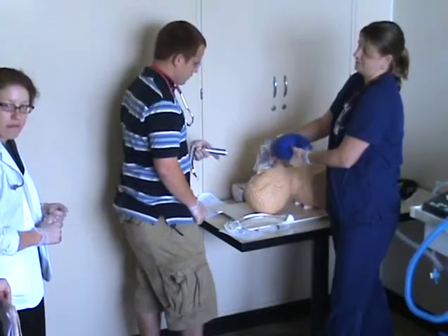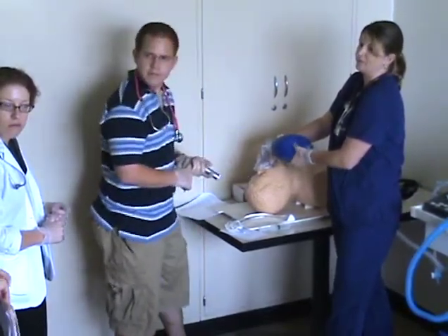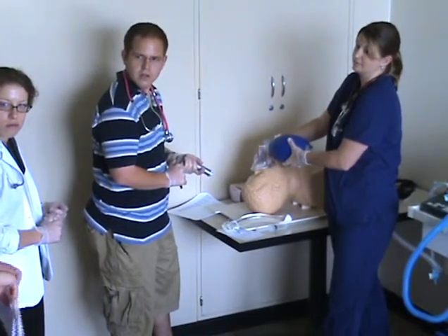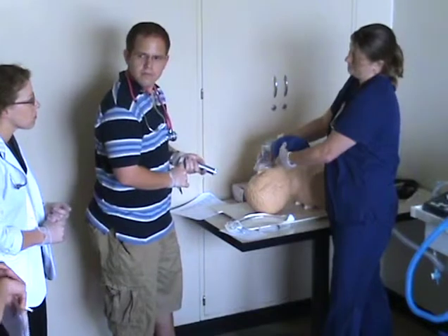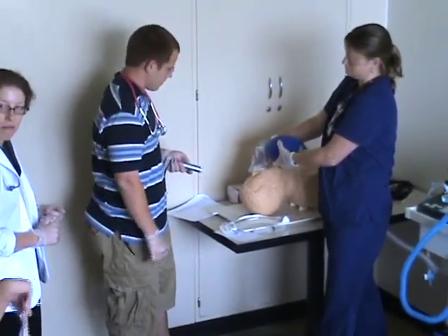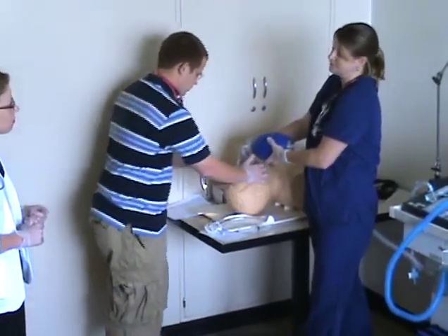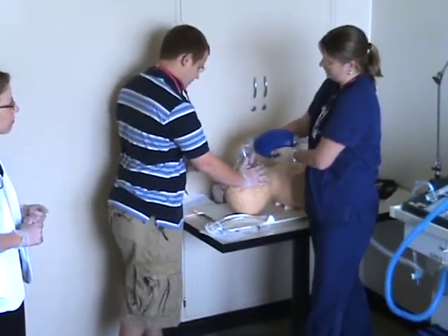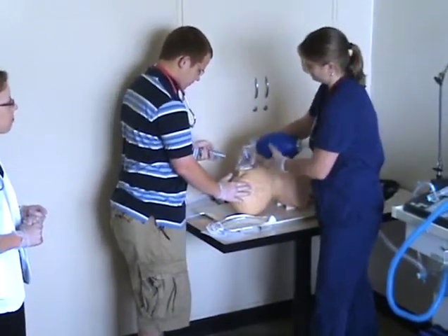Now, your patient appears pretty restless while you're trying to intubate. What could you do if he's fidgety? I can give him some medication if necessary. I can push 2 milligrams of Ativan to relax. All right, so we've done that, and you're preparing to intubate. Whenever you're ready. He's on C-spine precautions, so we are going to do the modified jaw thrust to open him up for intubation.